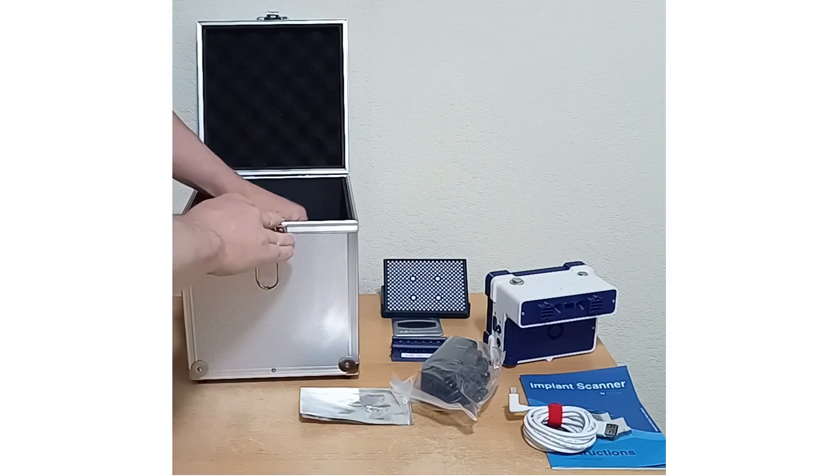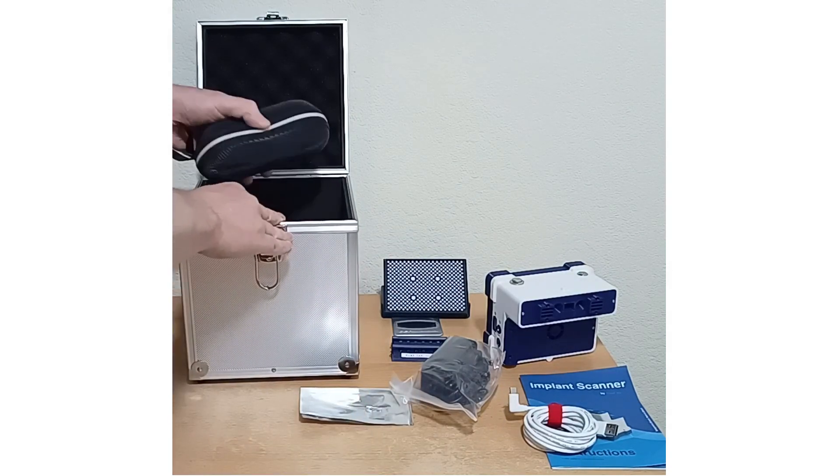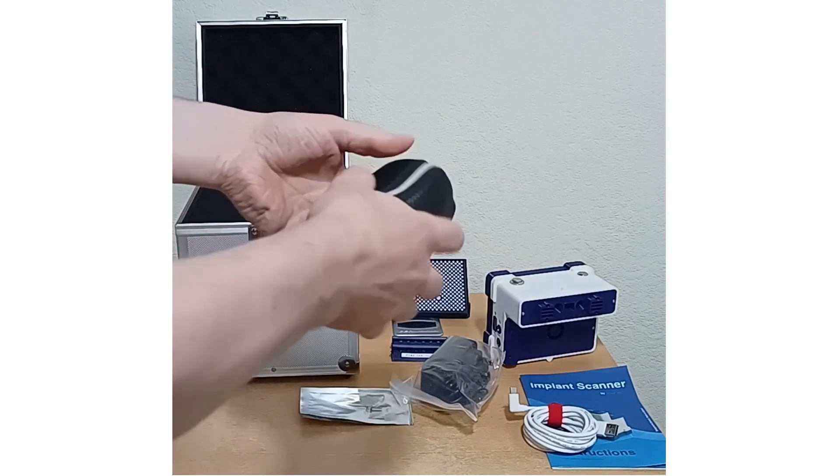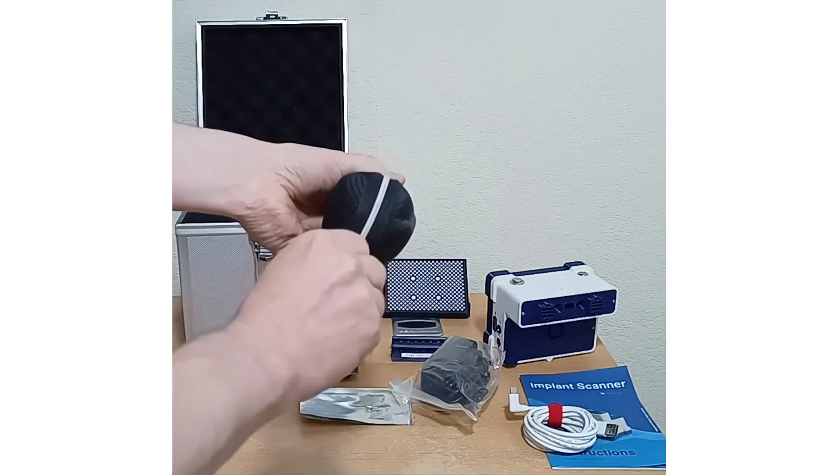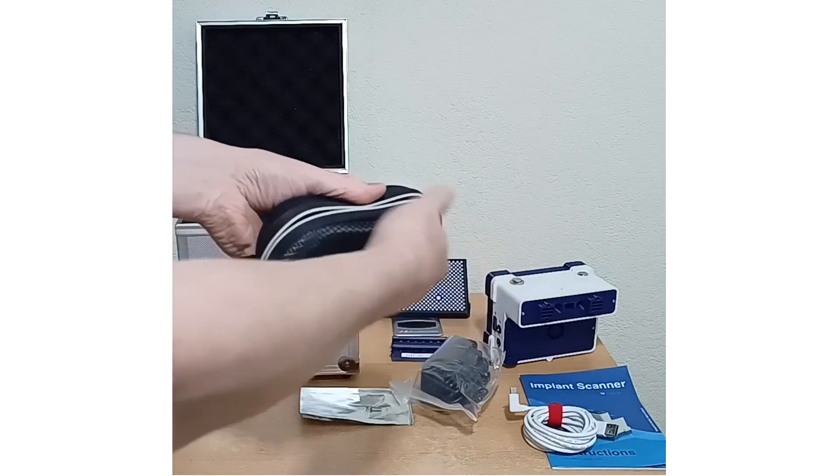Some safety glasses for the patient, because the green LEDs are very bright.